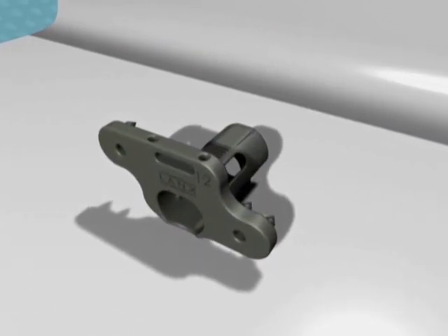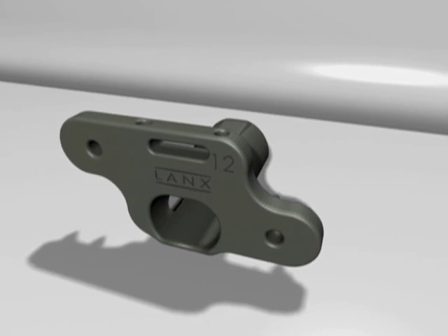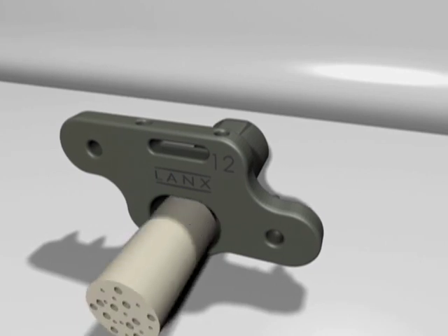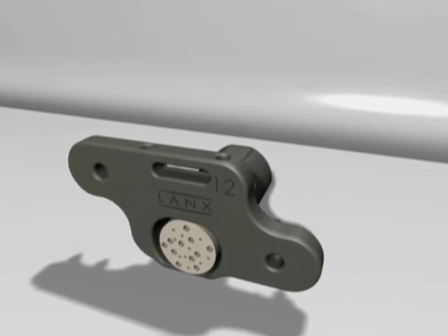The Aspen Spinous Process Fusion Plate is intended for use with bone graft material and is not intended for standalone use. The post-plate component of the implant may be packed with chips, flexible cancellous, DBM, or other bone grafting material.